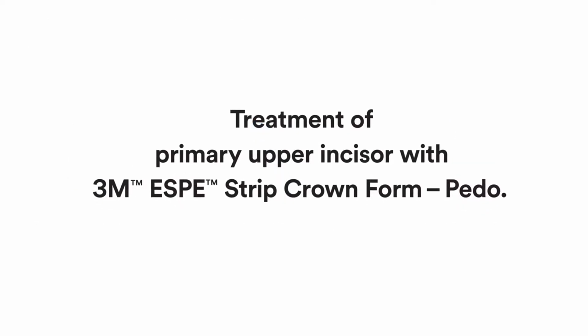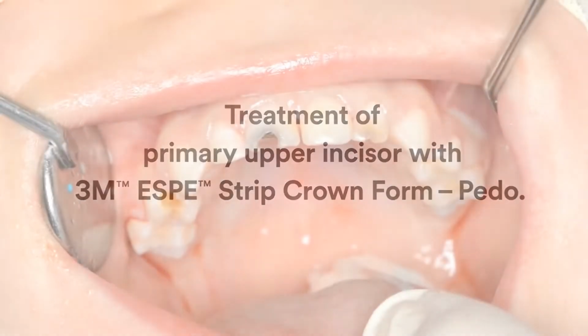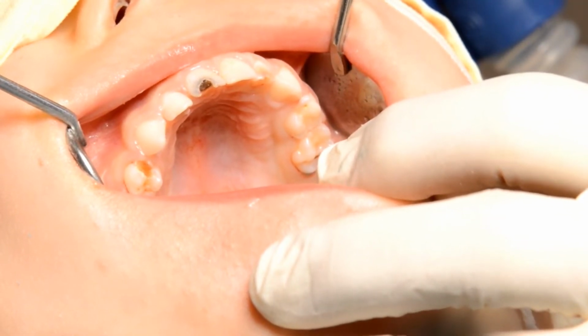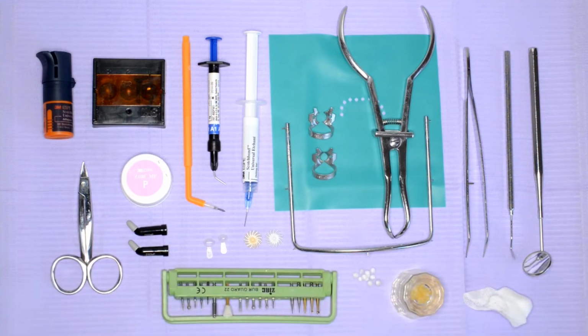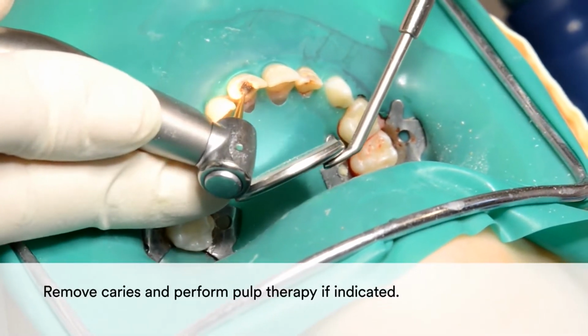This clinical case shows the treatment of a primary upper incisor with a 3M Strip Crown Form. Prior to starting a case, be sure to have all necessary materials and instruments handy on your tray. Then place a rubber dam to ensure a clean, dry environment and good visibility. If necessary, remove caries and perform pulp therapy.